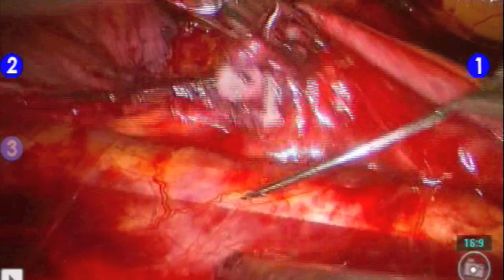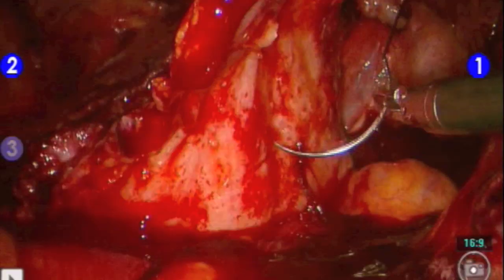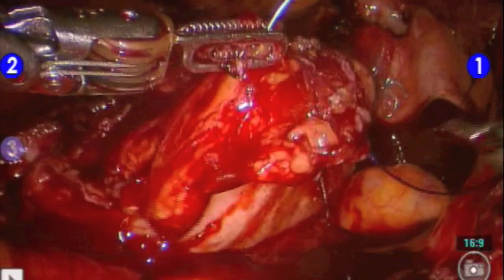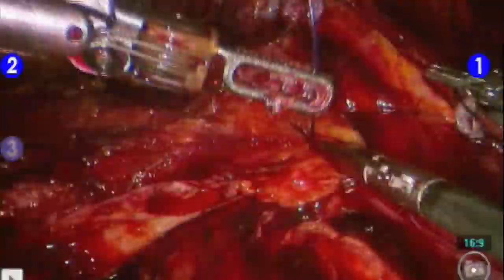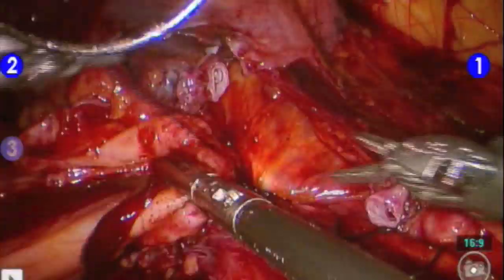We routinely perform a psoas hitch by placing a suture through the psoas tendon and into the bladder. The psoas hitch allows the ureter to be anastomosed in a tension-free environment.